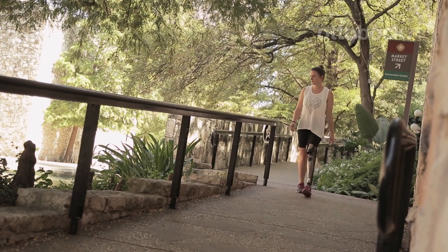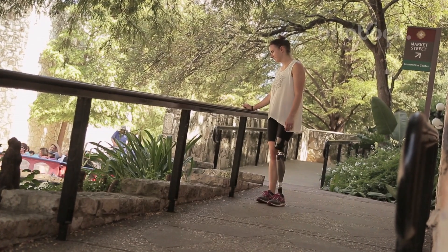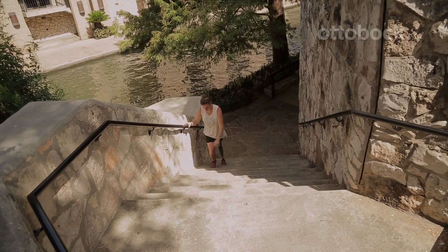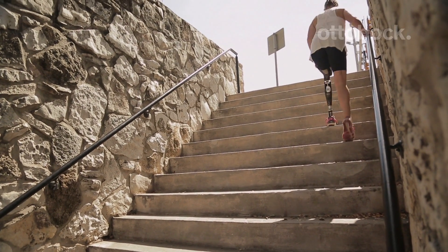If you're not comfortable activating the step up motion with stairs, the best way to practice is just by holding on to a hand railing on a flat piece of ground and practicing the motion over and over until you really get that motion fluidly, then take it to the stairs.